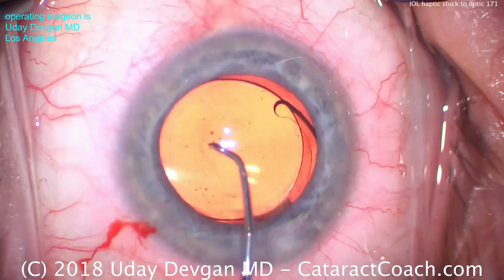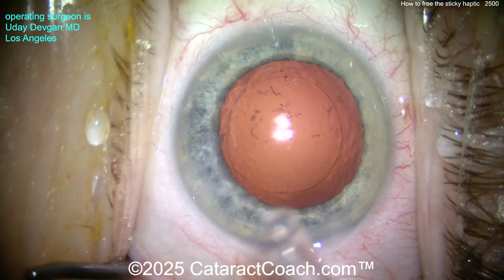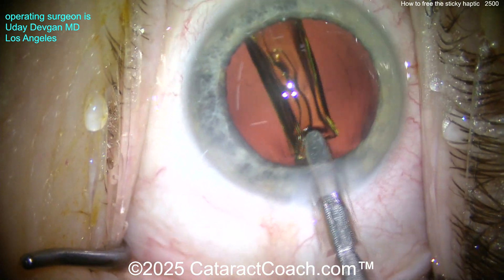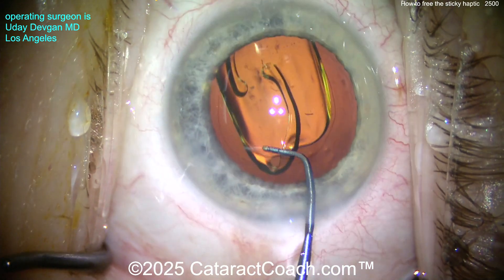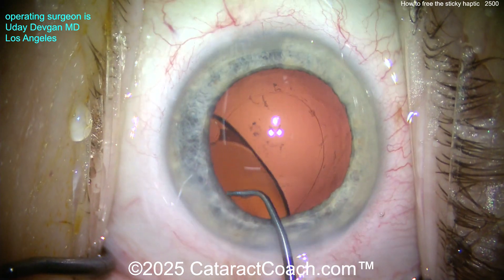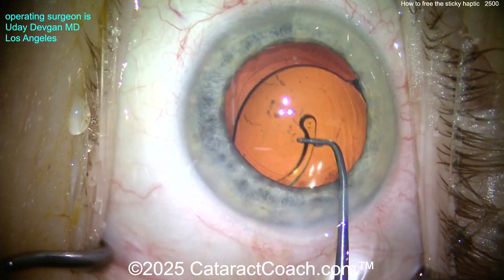Now it goes in the capsular bag — all done. That's how we usually deal with a sticky haptic on top of the optic, but sometimes it can be even more challenging. Let's show you a case I did just this week here in Los Angeles, in Beverly Hills. Again, routine case — here comes the lens, smaller incision, so a little bit of a wound assist. Get the eye back to primary position — don't put the lens in when the eye is shoved into the nasal canthus. There it goes into the capsular bag. Now deliver it, get it in position, and that one haptic — look — it doesn't want to come off. We try with the chopper, the usual methods, some shearing forces, but it's just really adherent.